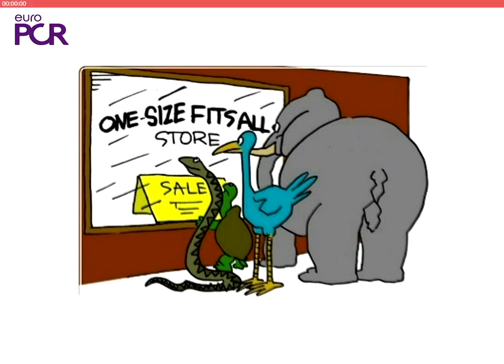Yes, please. Actually, just to follow on what you're saying, I think you've done a fantastic job. However, in a case like this, I probably would have avoided culotte because there's an increased risk of thrombosis with the aneurysm. Wouldn't it have been better to just put a stent in the circumflex and treat the diagonal just with a balloon, to reduce your chances of this happening? Whether that would help if he stops the antiplatelet or not, we don't know.